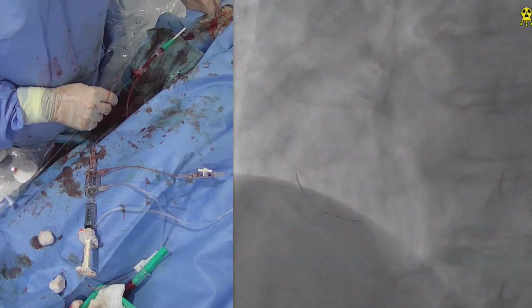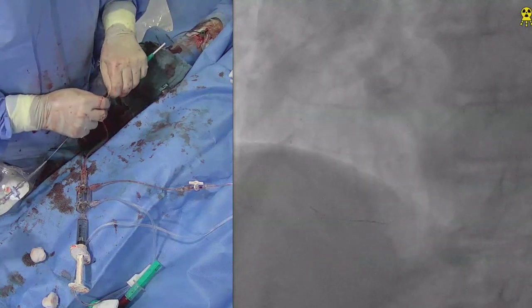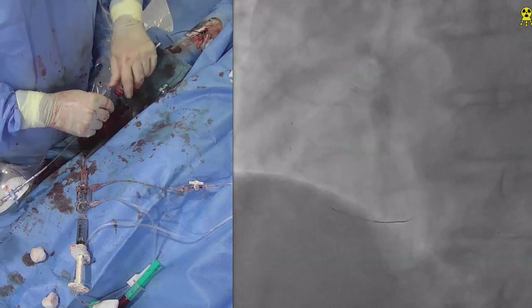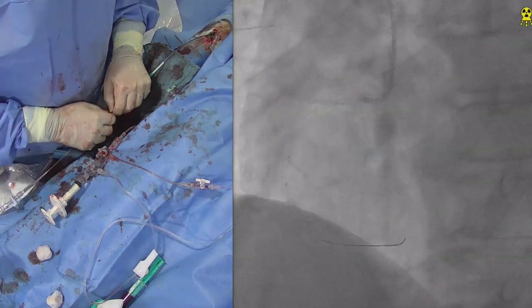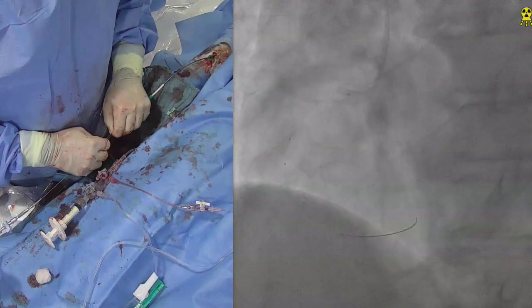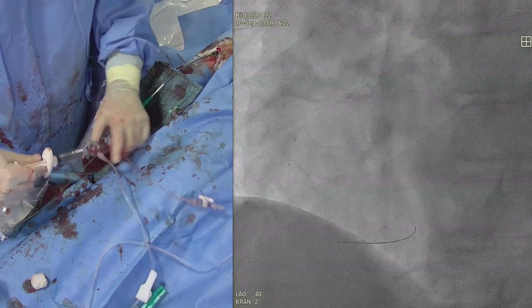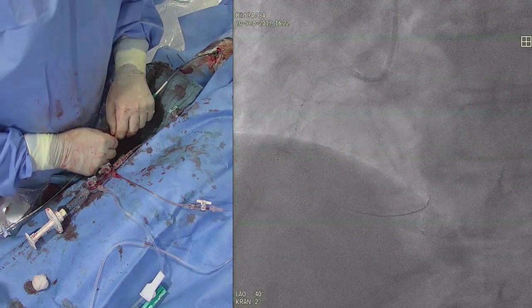So the first challenge is to see how well the balloon crosses the lesion. Is it a non-compliant balloon, or just a regular balloon? It is a 2.5 non-compliant balloon, yes. Now we're down distal. The non-compliant balloons have a worse crossing profile than compliant balloons, just for the audience, and especially after they've been used. This one hasn't been used. Probably at the lower end of it. Yeah, true, but I want to make sure, because it was not that easy to cross it. Exactly, I want to make sure that we don't dislocate it.